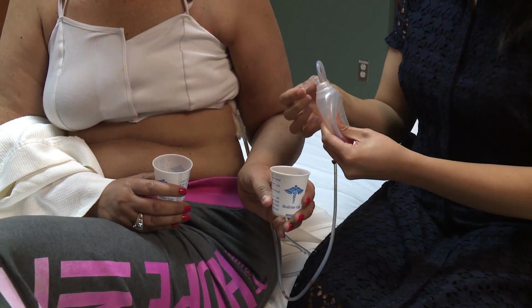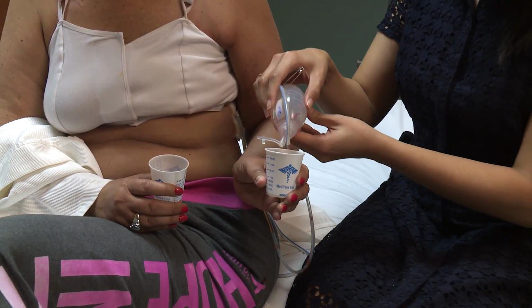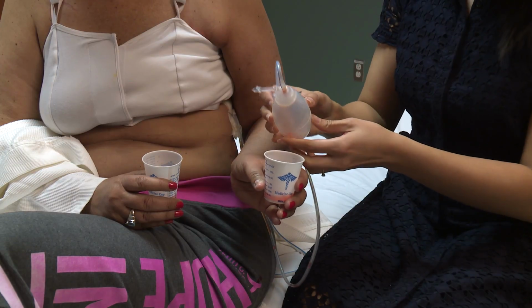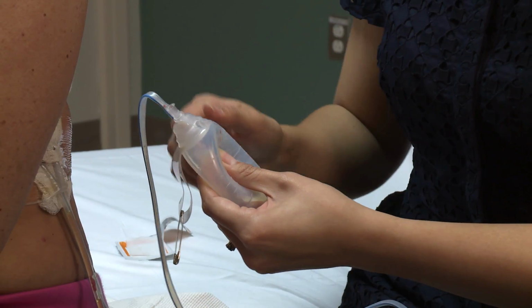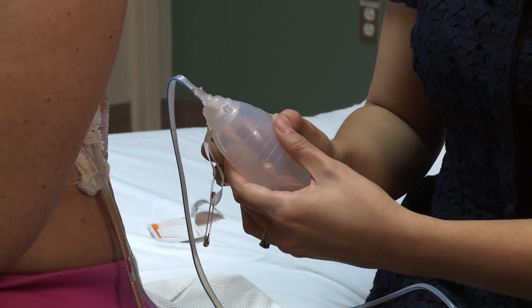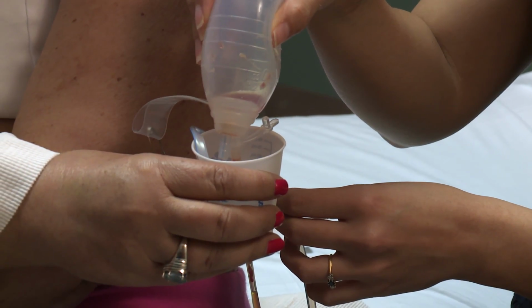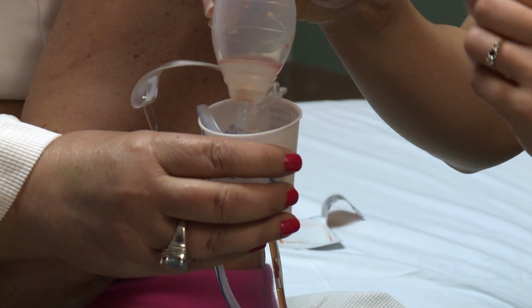At least 2 times a day after you have stripped the drain, empty the fluid collected in each bulb into a separate measuring cup. To empty the bulb and measure the fluid, follow these steps. After stripping the drain, unplug the stopper from the emptying port located at the top of the bulb. Tip the bulb upside down over the measuring cup. Gently squeeze all of the fluid from the bulb into the measuring cup. Your nurse will give you measuring cups.